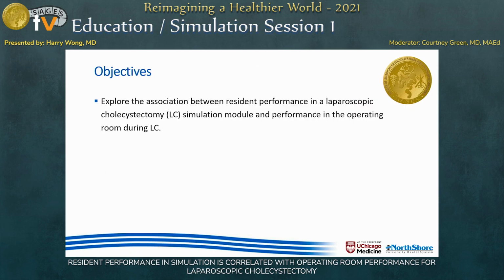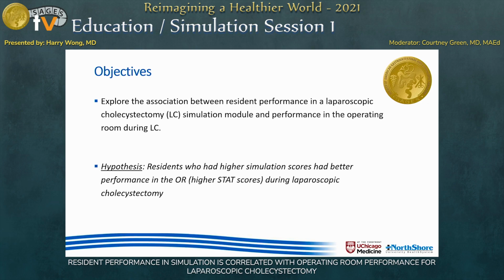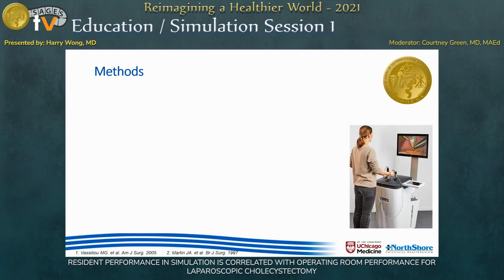So using this tool, we wanted to explore the association between the resident performance in a lap chole simulation module and their performance in the OR doing a lap chole. So we hypothesized that residents who had higher simulation scores will perform better in the OR during lap choles.